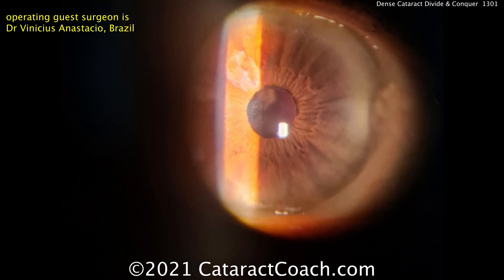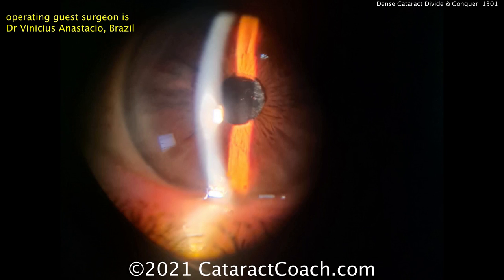Here's post-op — look at that. Post-op day one. Nice looking eye. Clear cornea. This patient is absolutely thrilled. Thanks for sending the video.